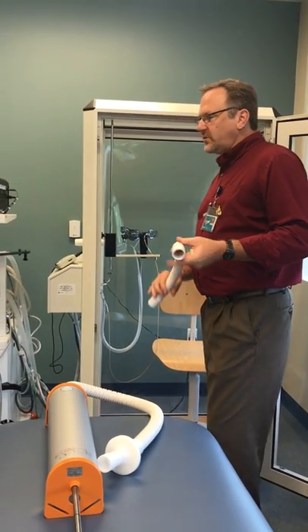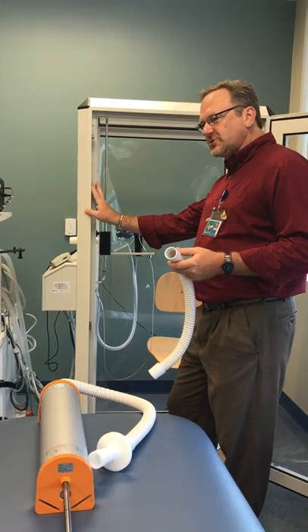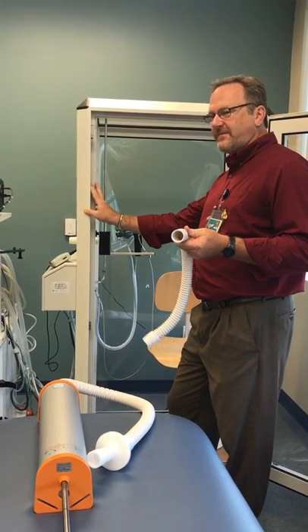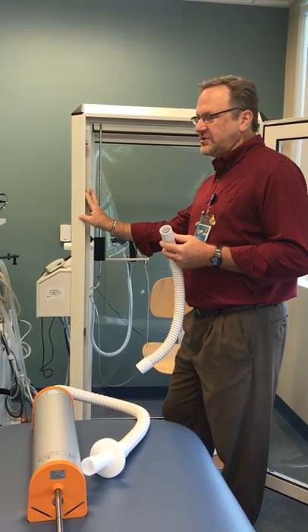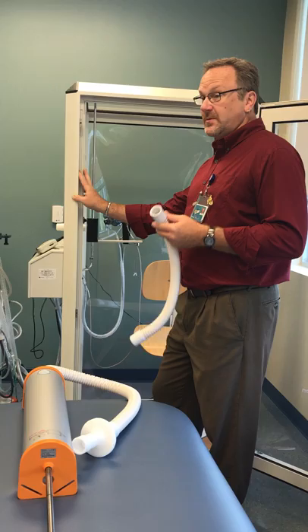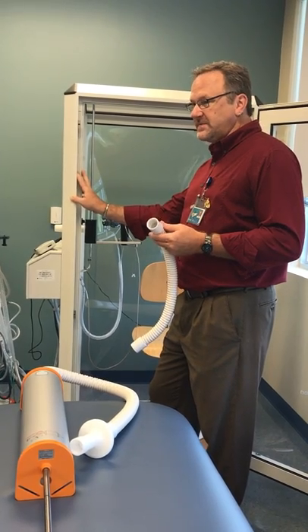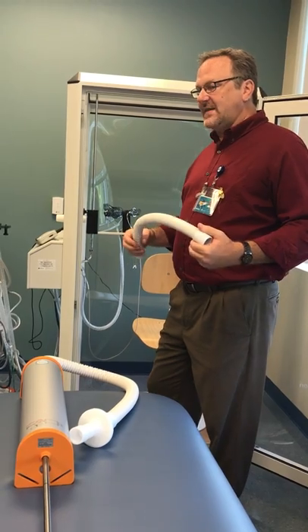This video shows how to physically set up the plethysmography box for the test and also for the calibration. You should have already watched the video on how to do the computer portion of the calibration. This covers how to set it up for both the test and the calibration.